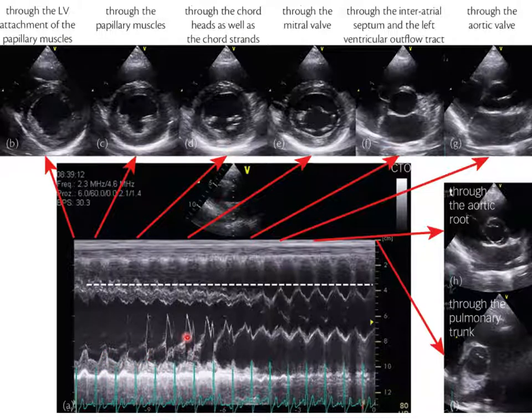And then as we start to see, papillary muscles, they are echoes that are inside the chamber that change as a function of time with each heartbeat. And then here are valve planes that are also changing as a function of time with each beat. So that's M mode scanning. That's what this is called.